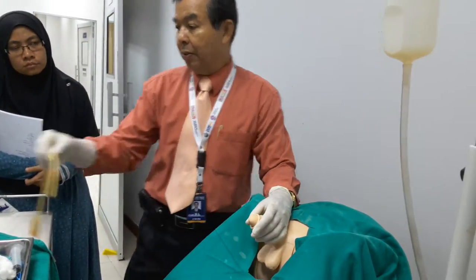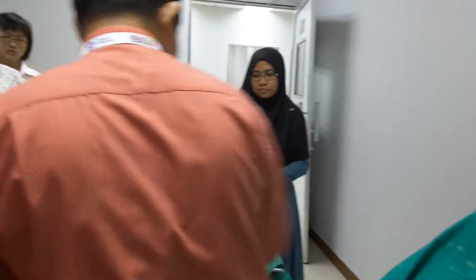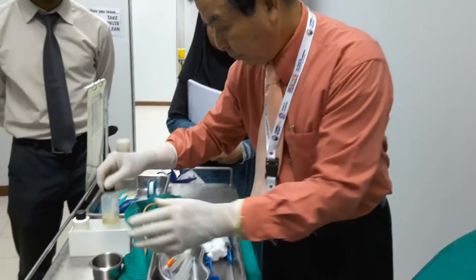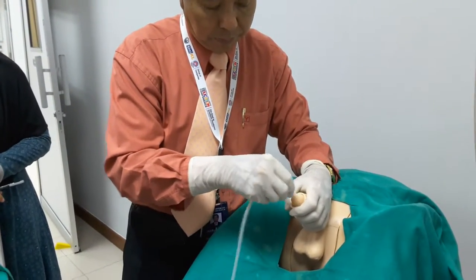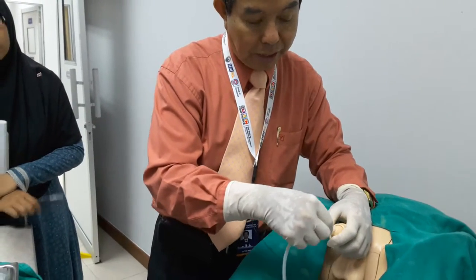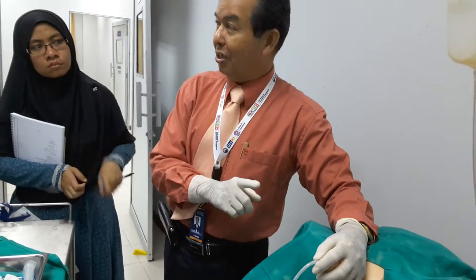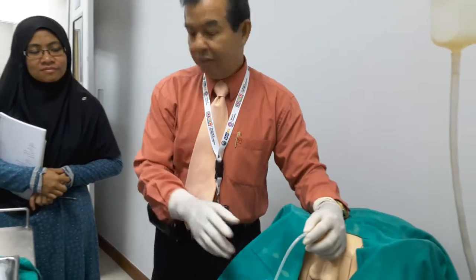Using the stopper, I pull this one and advance the catheter. Near the posterior urethra, there may be a little resistance and difficulty pushing it in. That is why I suggest not asking students to perform catheterization during exams, as this kind of difficulty makes it inadvisable in that setting.